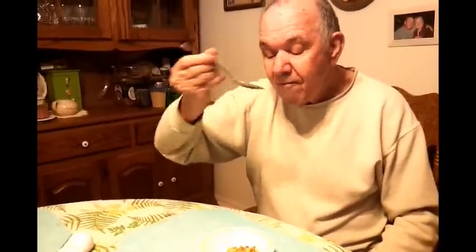So, like, if you were eating rice or something like that, you could actually get it to your mouth. Or, like, a bowl of berries or something like that.